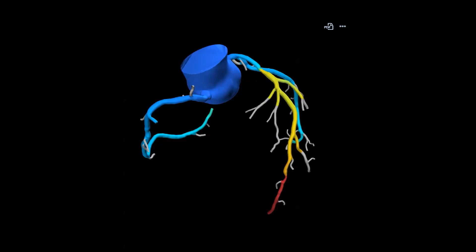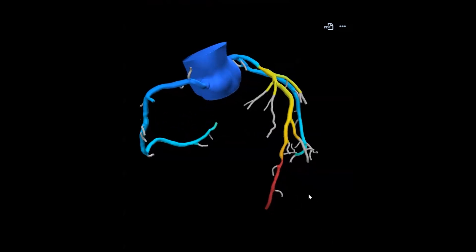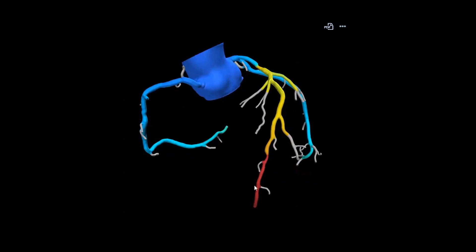In this separate patient, corresponding to an area of narrowing in the LAD seen on CTA examination, there is decreased blood flow, signified in red, and this indicates that the patient should be stented.